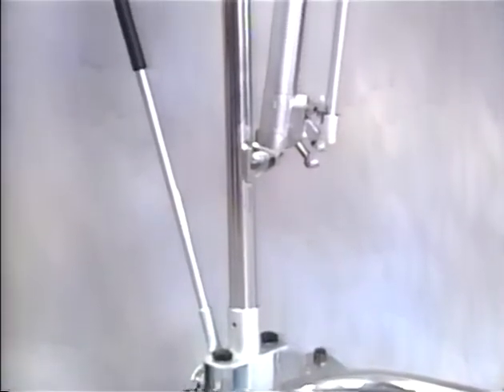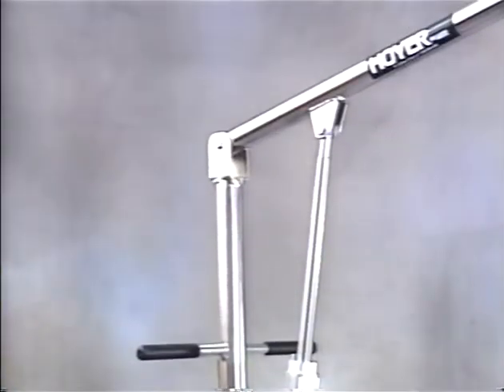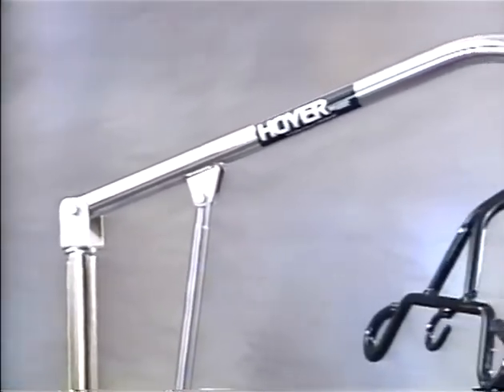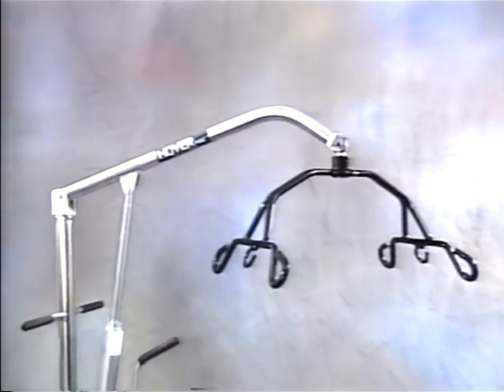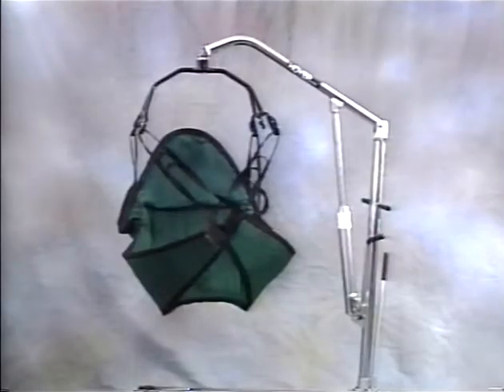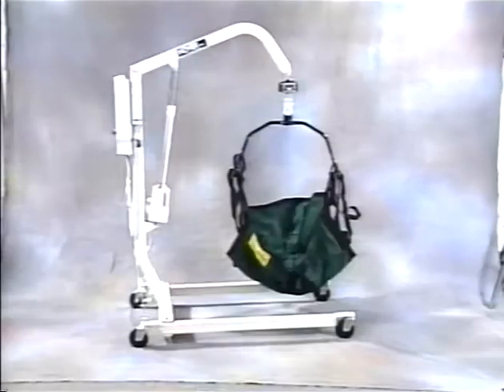The upright section of the lifter is the mast, which provides vertical support for the lifter. Attached to the mast is a handle for moving and steering the lifter. The boom, which provides the lifting motion, is also attached to the mast. The cradle attaches at the end of the boom. A variety of slings, each for different lifting situations, attach to the cradle. Slings support your passenger during a lift.